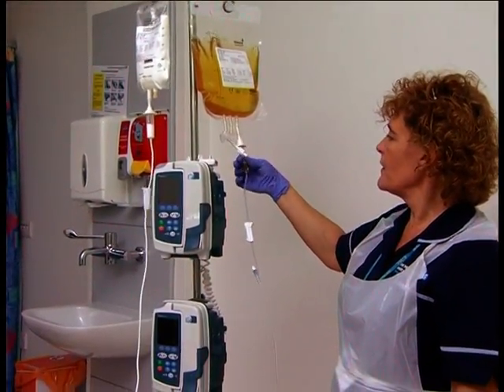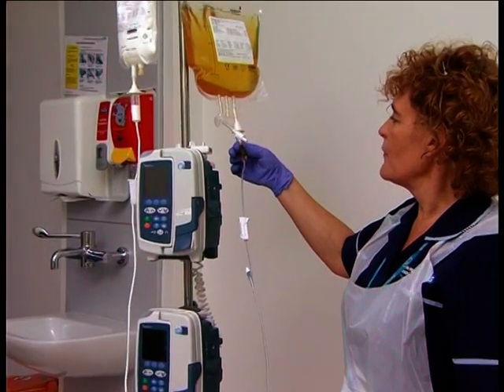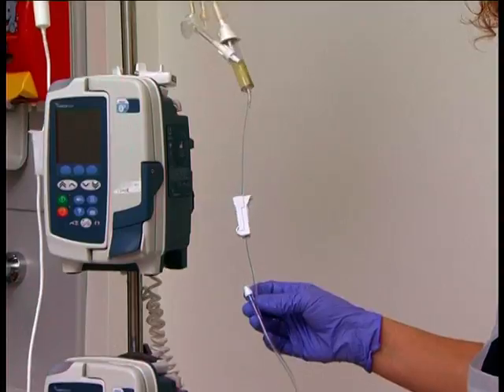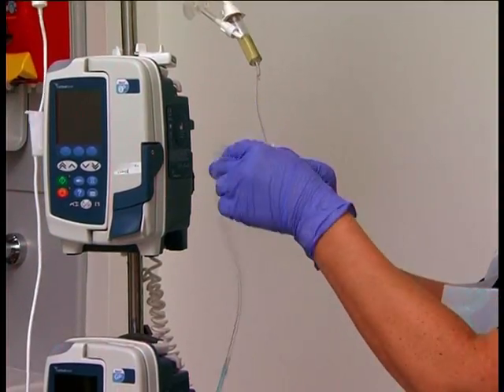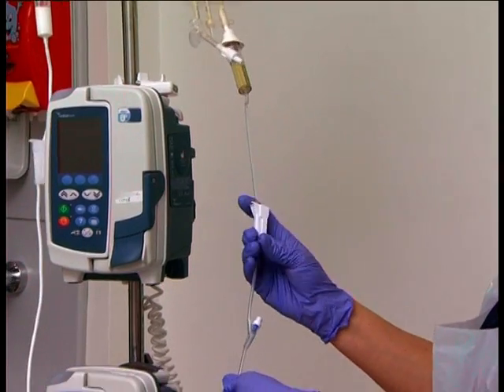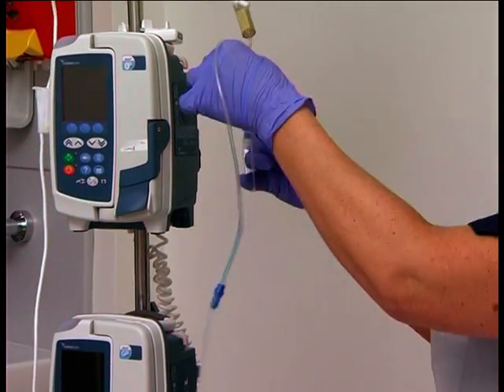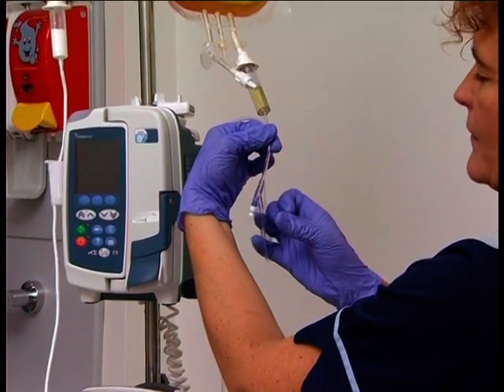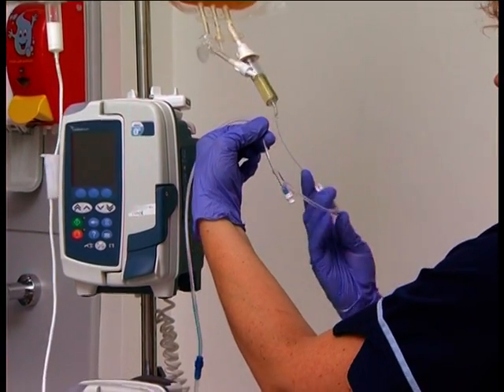Gently squeeze the giving set chamber until it is approximately half filled with fluid. Slowly release the roller clamp and allow the fluid to run through the giving set. As the fluid flows past the smart sites, you will need to invert the set and tap until the air is expelled.